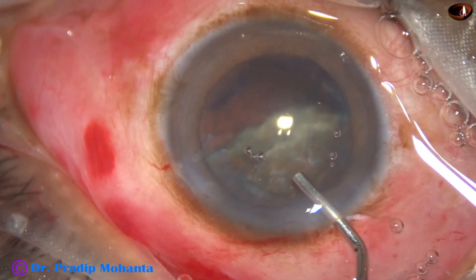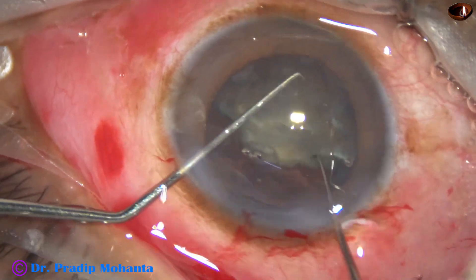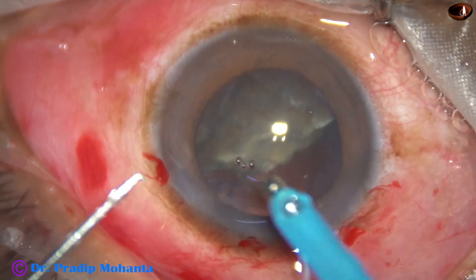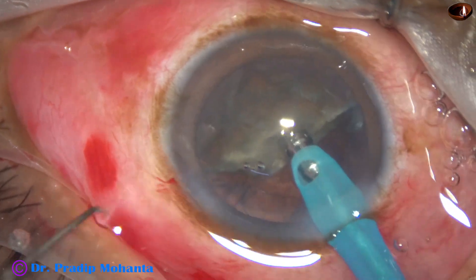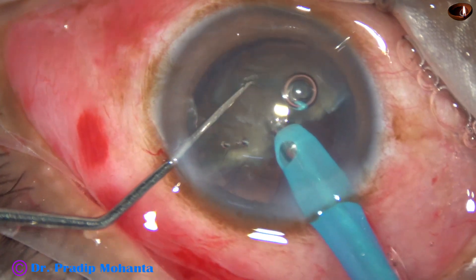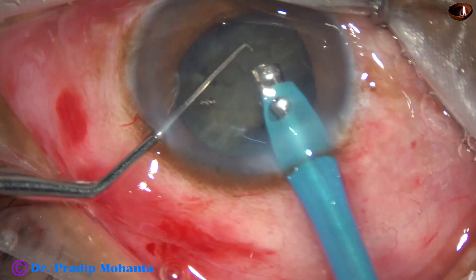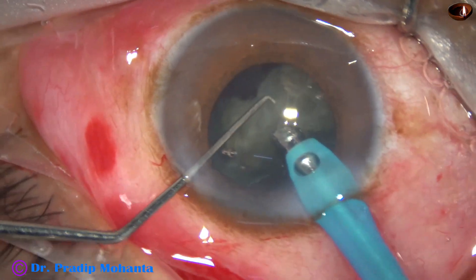I inject visco and use two hooks to orient the remaining hemi-nucleus so that I get access to the inner edge easily. I go through the hemi-nucleus from the central part. There is again some joining between the two pieces, so I apply some ultrasound to make these two pieces free.